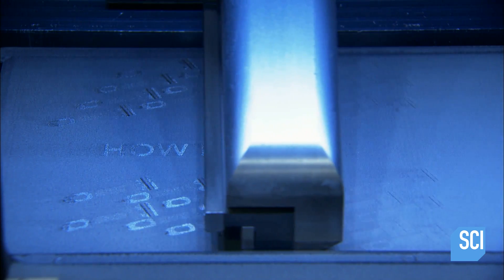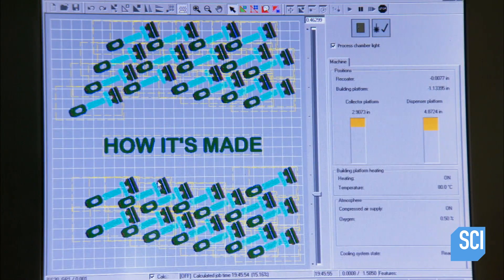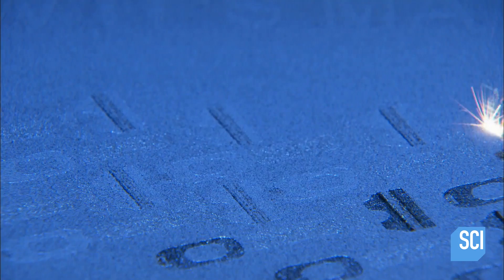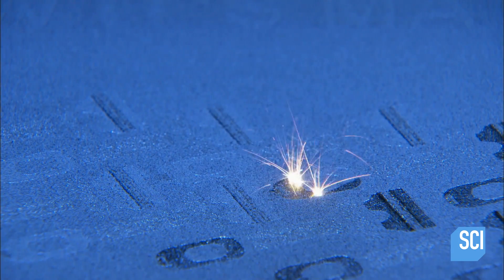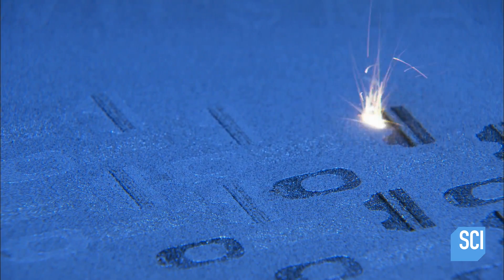The computer, which recorded the bone cuts, guides a 3D printer to produce plastic templates for both the femur and tibia. The surgeon will use these to repeat the exact same cuts in real life.